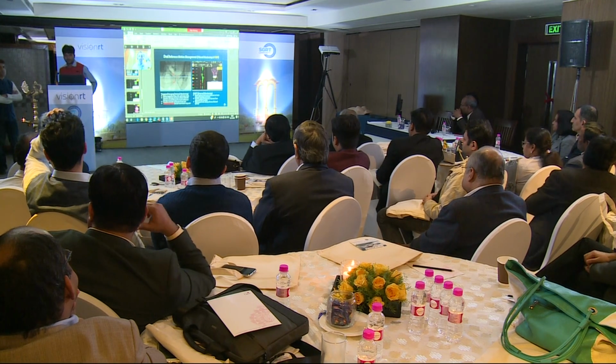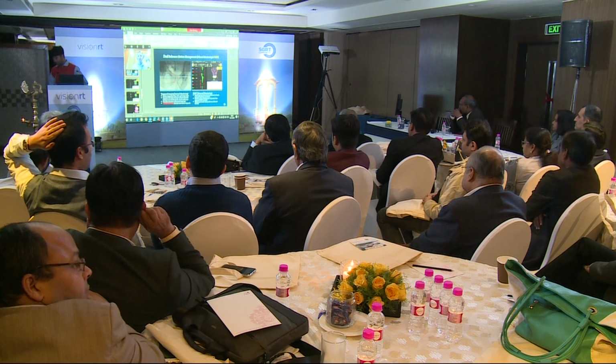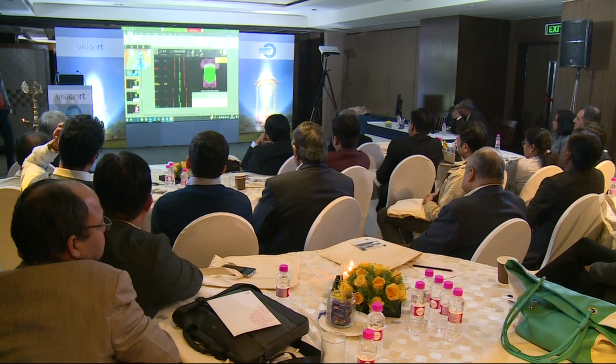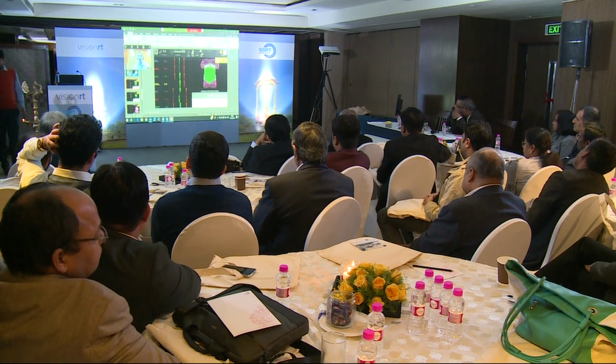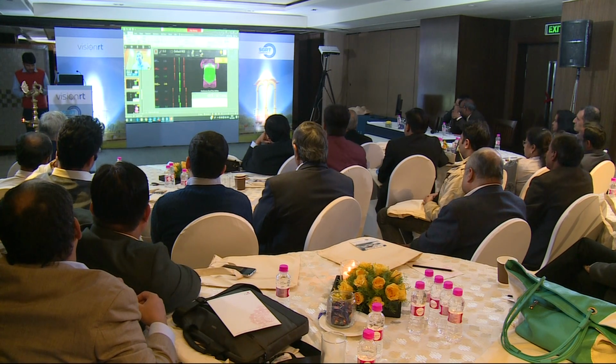So moving on to slide 14, this is another place where surface-guided radiation therapy excels. The AlignRT product allows you to have multiple ROIs. In this case, this is a GI case, or a GYN case, I apologize, that has a full periaortic trunk, again on slide 24. And in this case, we have 6D couches, but 6D couches do not correct for all of your sins of setup.